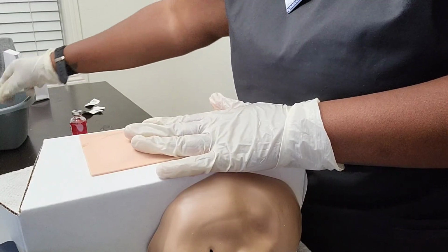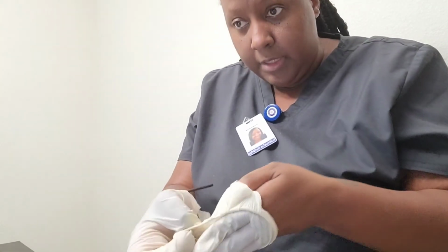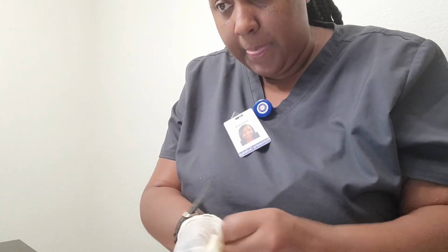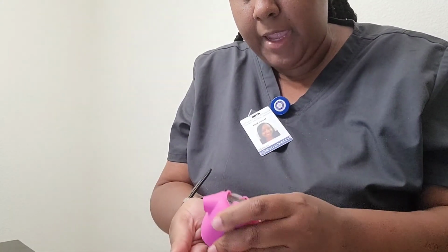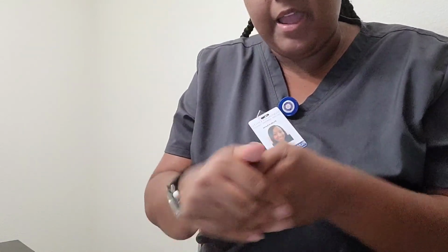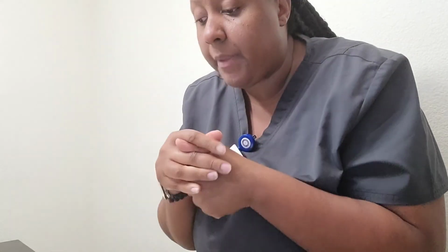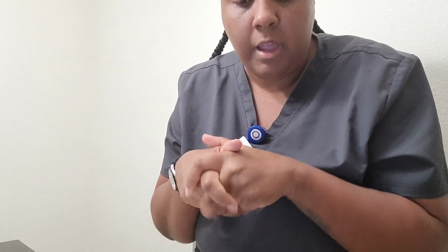And so then I can remove my gloves, and then perform hand hygiene. And then I will document this procedure. I will leave the patient in a comfortable position. And yes, I will document the procedure, and that is it for this video.